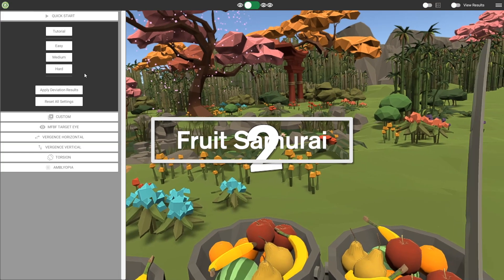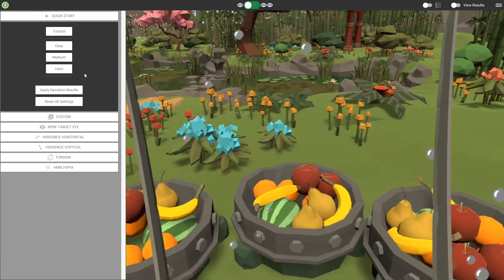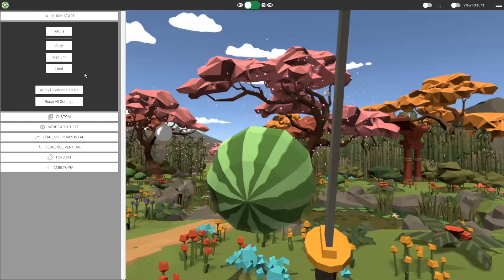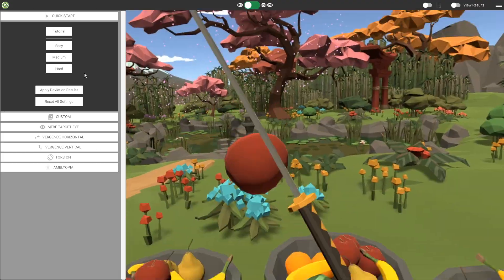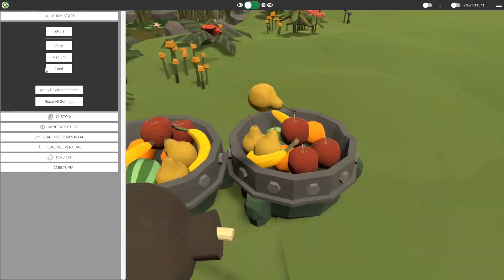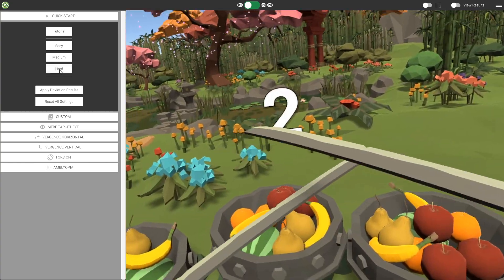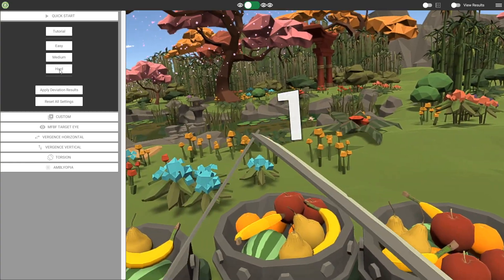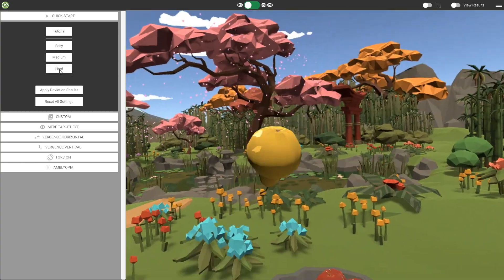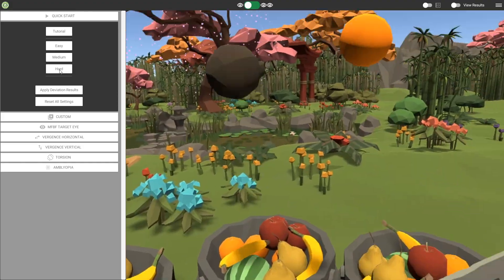Next we have Fruit Samurai. This is an eye-hand coordination activity where you use your katanas to chop fruit. The objective is to chop as many fruit as possible and avoid chopping the bombs. The Easy, Medium and Hard settings will increase the number of fruits that spawn at one time.